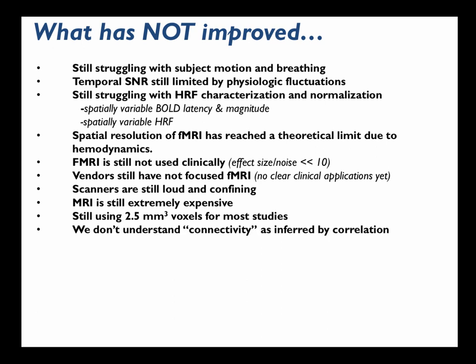And this is an important point that I always like to harp on a little bit: even though resting state functional connectivity works so well, we actually don't understand what it's for. Why does the brain show this connectivity at these low frequencies? There are many other ways of changing the correlation of two time series other than changing the connectivity of those regions.